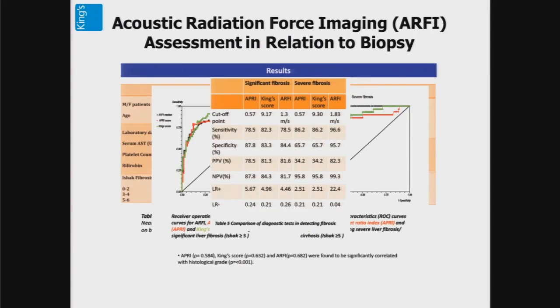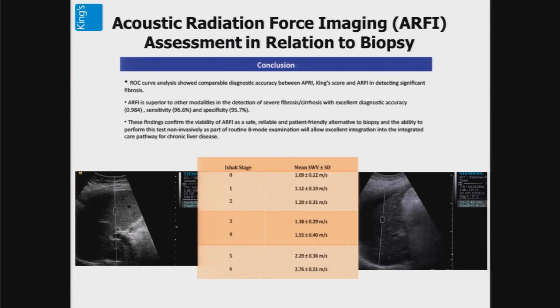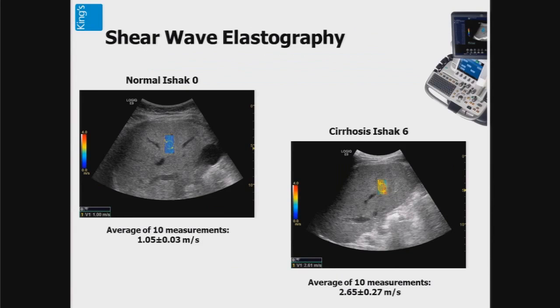And that's quite a difference between the two. So you have a useful tool there in your cupboard when you're looking at these sort of patients to actually make a diagnosis for the clinicians of what is severe, significant, and what is normal.